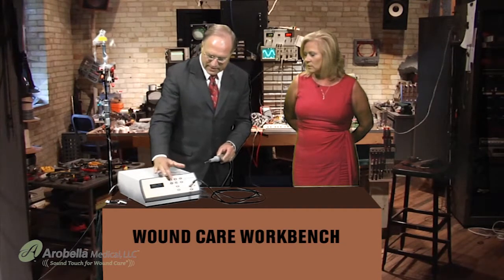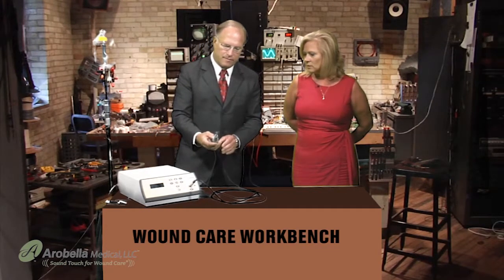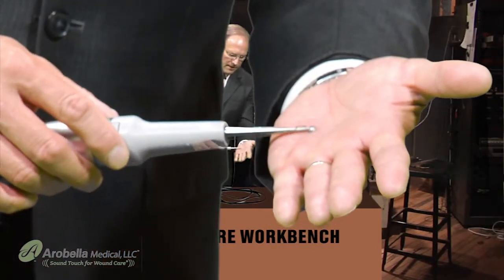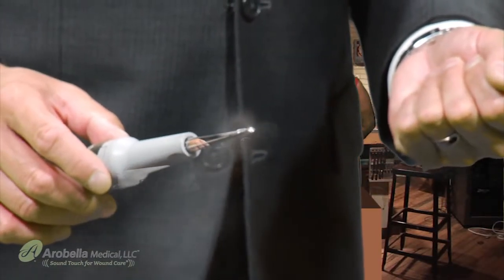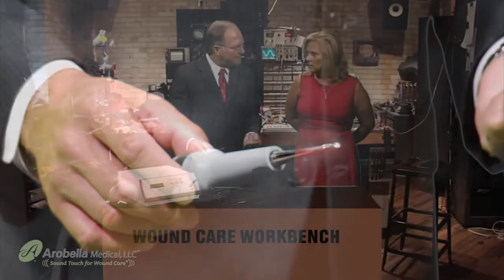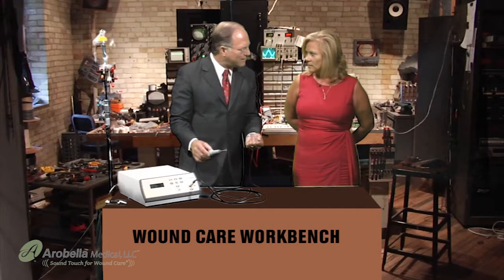The unit is already powered on by simply pushing the on-off button. We then activate therapy and pass this probe over the wound base. To really understand what is going on with this technology, there's a lecture going on about ultrasound-guided debridement.